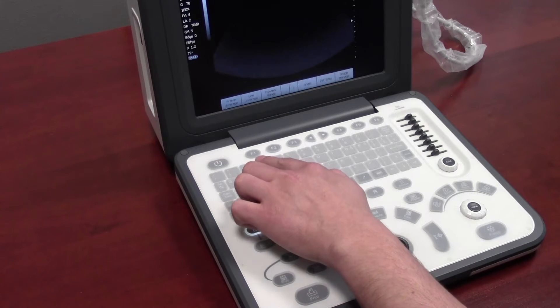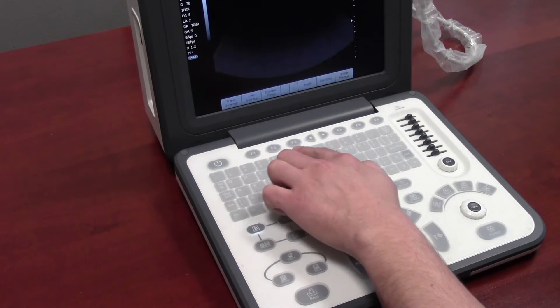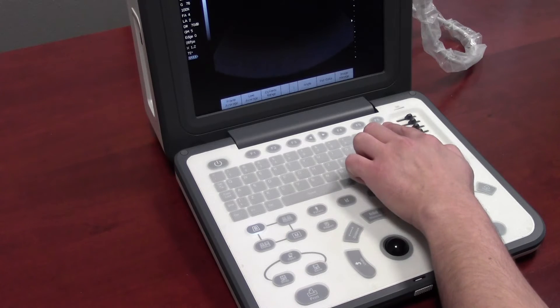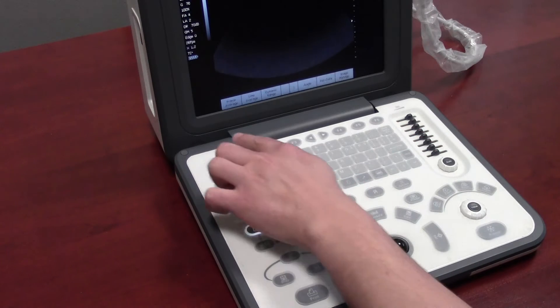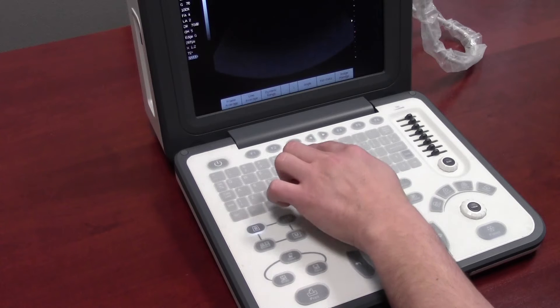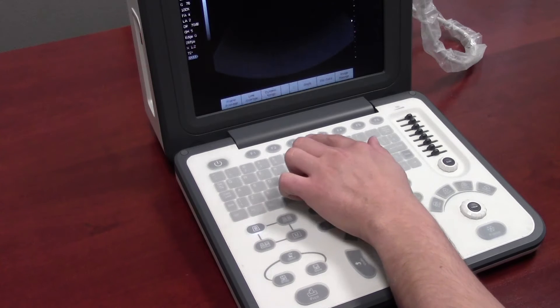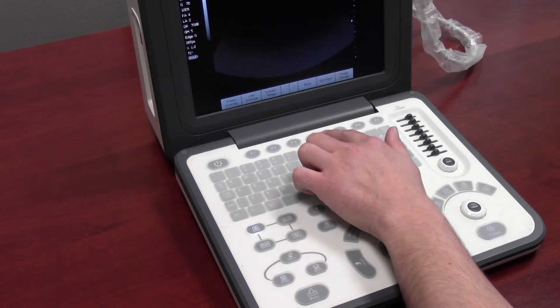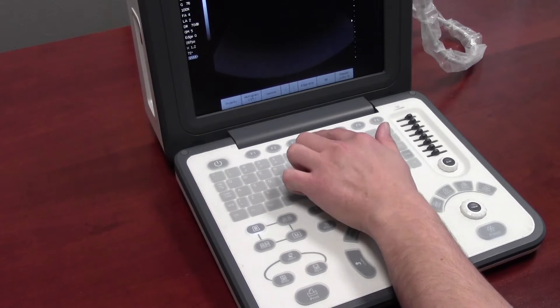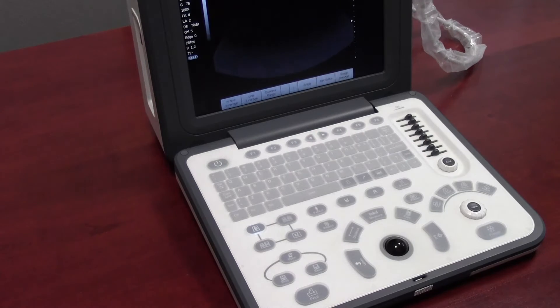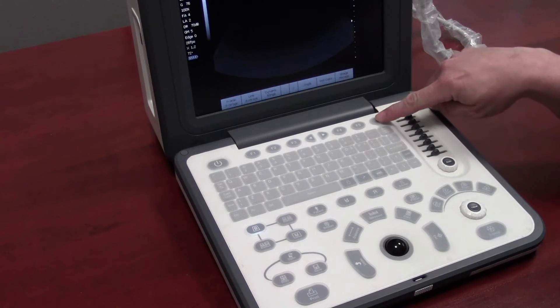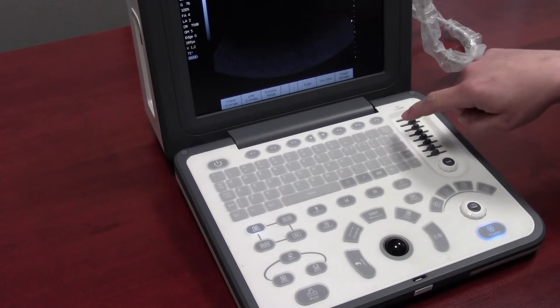The F1, F2, F3, F4, F5, and F6 keys will all relate to the menu here. You can navigate through that menu by pressing the left and right arrows. Go to image management by pressing F6.